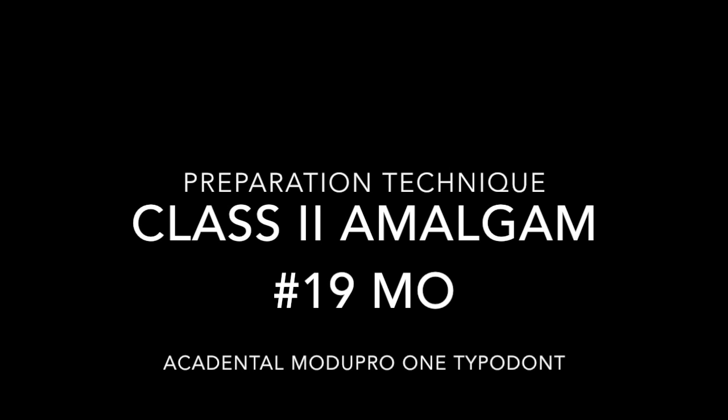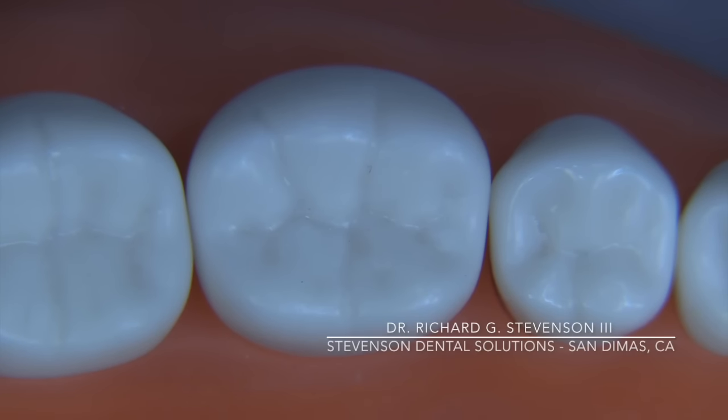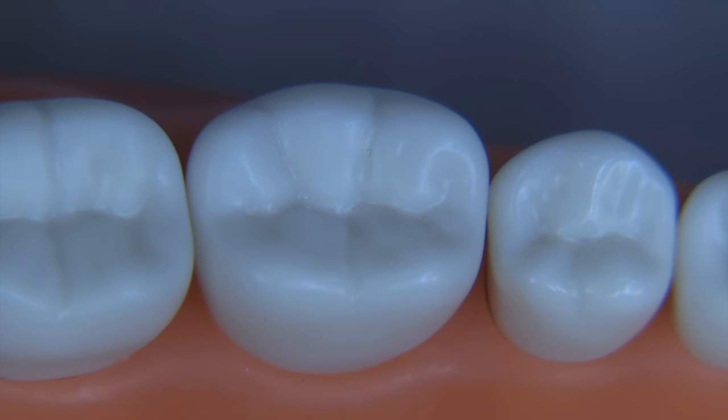Hi everybody, today we're going to do the class 2 amalgam on tooth number 19. I'm Dr. Richard Stevenson, director of Stevenson Dental Solutions in San Dimas, California, and today we're going to use the Acadental typodont, the ModuPro One. It's a great typodont and I thought it'd be nice to do a prep on this tooth.